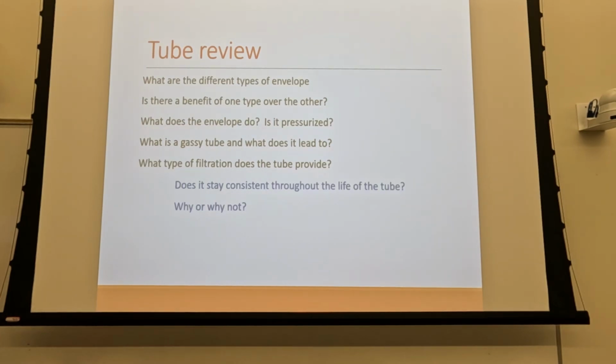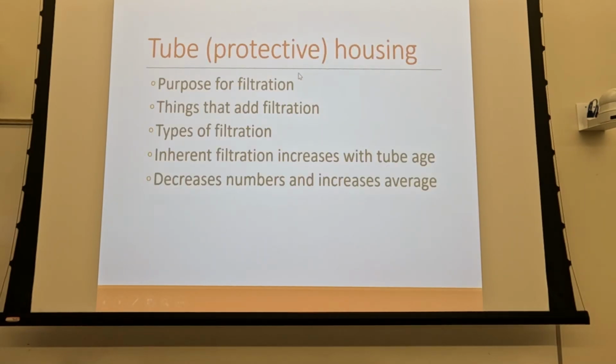We'll introduce that for everything that we use and every component that we use and every setting that we set. We have specific quality control measures that we have to abide by. So a physicist comes in once a year and takes a look at everything. All right, so we talked about gassy tubes and all that. We talked about different types of filtration. Did we get into filtration really much? Just a little bit. Okay, so we did talk a little bit about filtration.